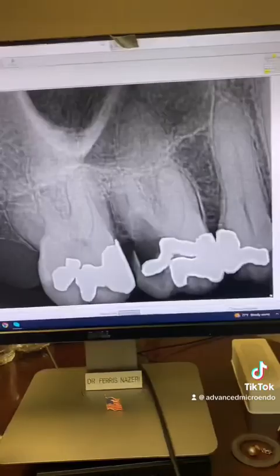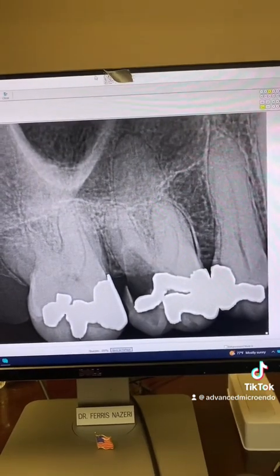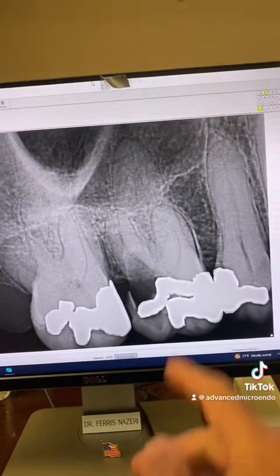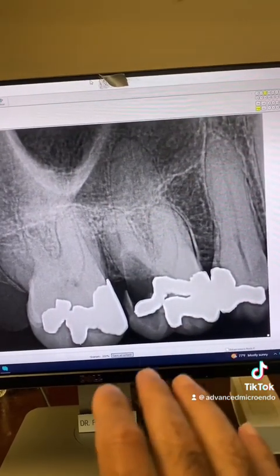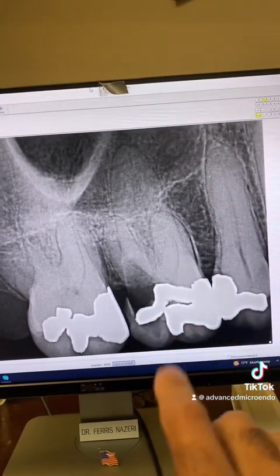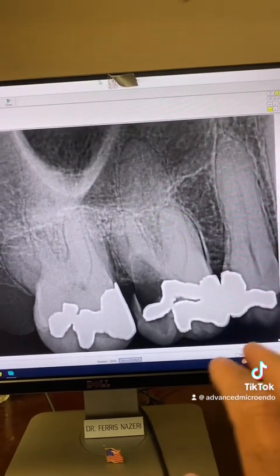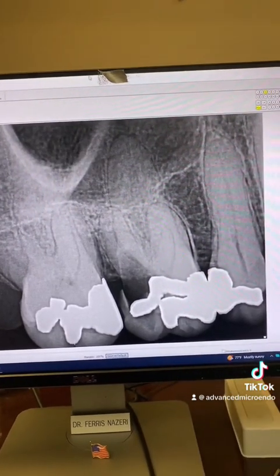So take a look. This is subgingival decay, so patient is well aware. She will need a crown lengthening. You can see old amalgam, recurrence of gingival decay, and partially calcified canals, as you can see. And that's what happens with teeth when there is decay over the pulp chamber, and the canals, they calcify. And that's happened in this case. Also patient's age. This patient is a bit older.